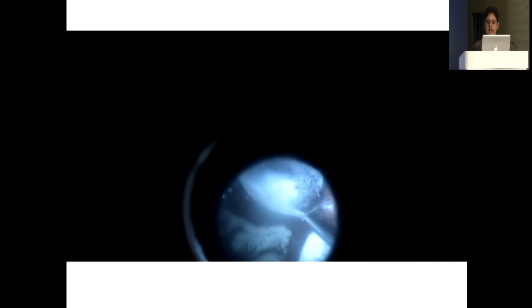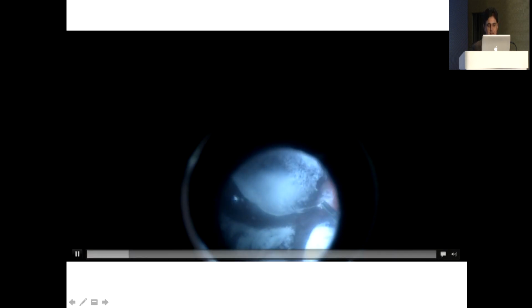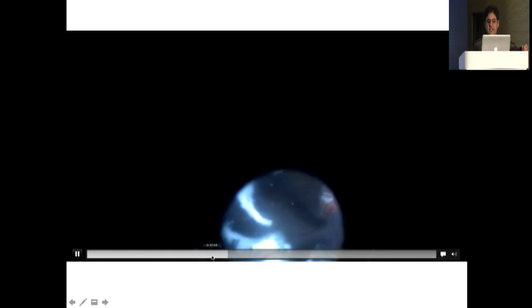So this is another video in which I did ILM peeling after induction of the PVD, which is the most important step. The ILM peeling should be foveal sparing because usually the retina is very thinned out and it can lead to complications like macular hole. I'll just fast forward this video a bit. After induction of the PVD, injecting triamcinolone is a very good idea because you will be able to see the vitreous, as it is difficult to induce a PVD. So a foveal sparing ILM peeling was done, and one of the pieces of the ILM was then plugged into the pit.